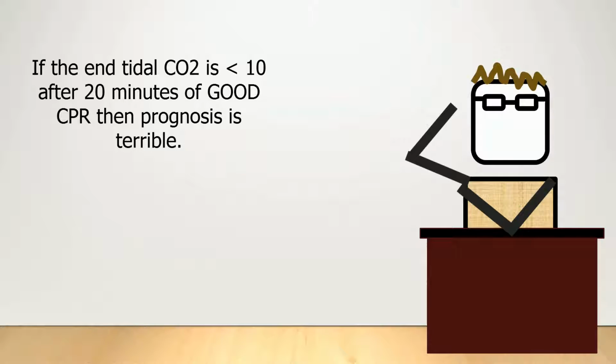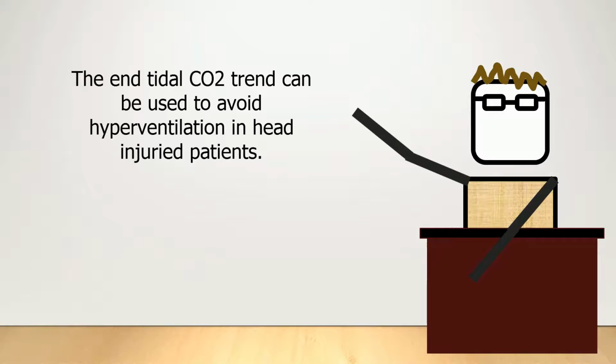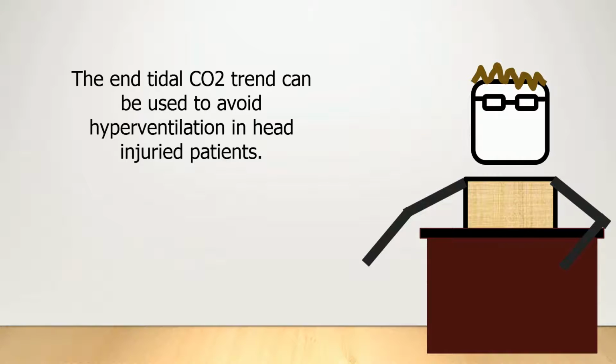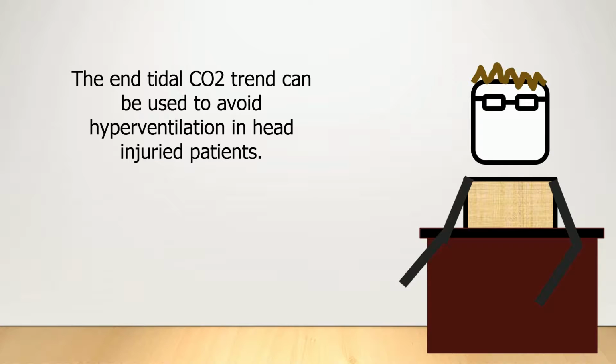And finally, the capnography is vital in avoiding hyperventilation in head-injured patients. Recall that aggressive hyperventilation is very bad in head trauma as it causes cerebral vasoconstriction and subsequently ischemia. The capnograph is invaluable in maintaining a normal CO2 for that patient and preventing iatrogenic harm with the ventilator.